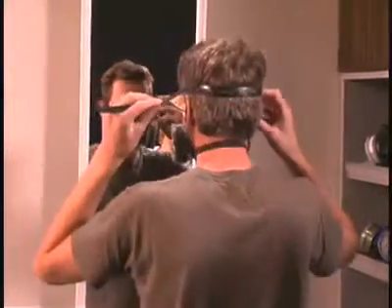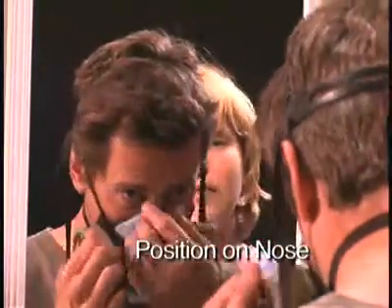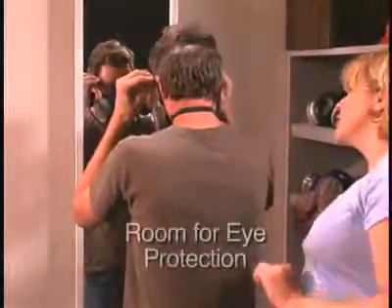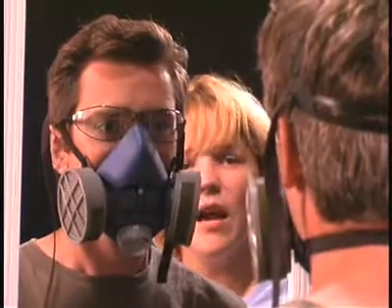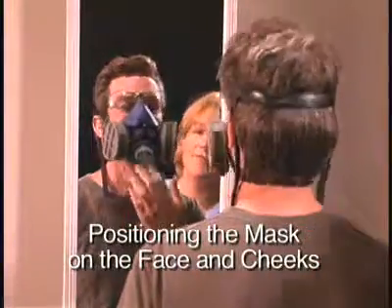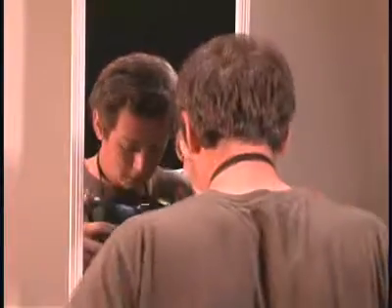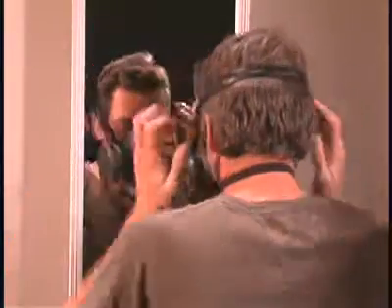Give the subject time to determine the comfort of the respirator on the following points. Positioning the mask on the nose. Room for eye protection. Room to talk without breaking the seal. And positioning the mask on the face and cheeks. Subjects who are unfamiliar with using a particular respirator must don and adjust the facepiece several times to become adept at setting the proper tension on the straps.